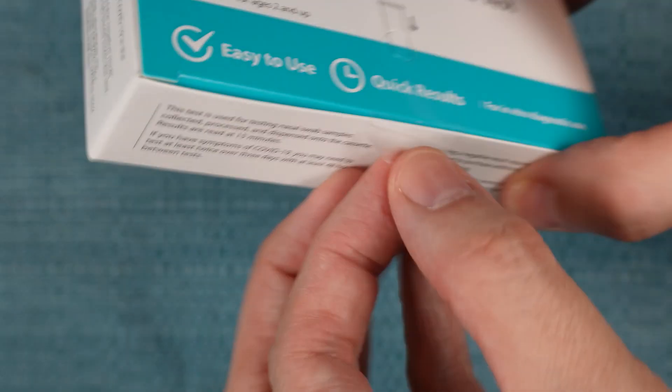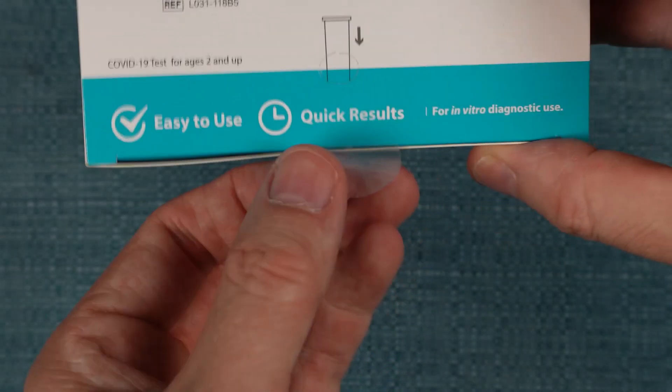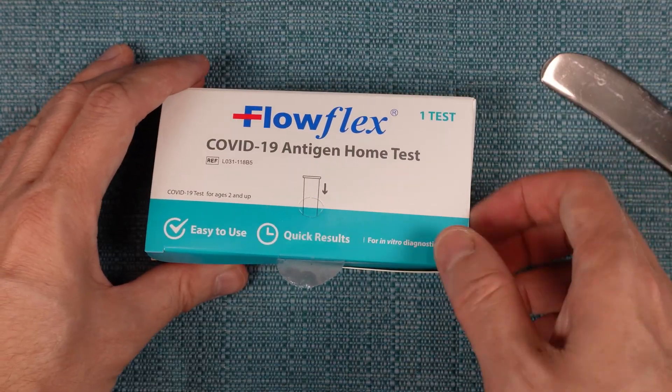It's best to open it by peeling up this tape that goes around the corner of the box, and then carefully pull the lid up. A butter knife can help out with that.